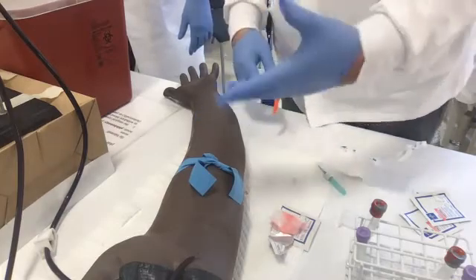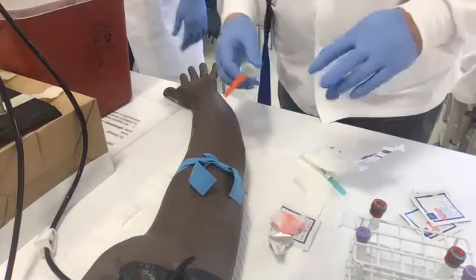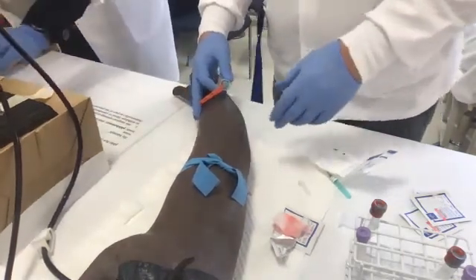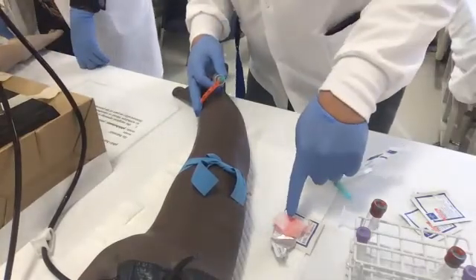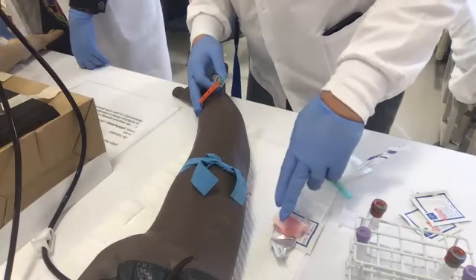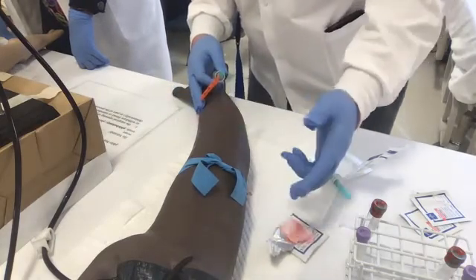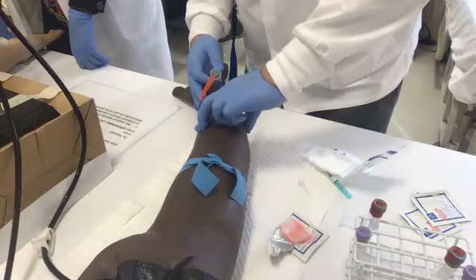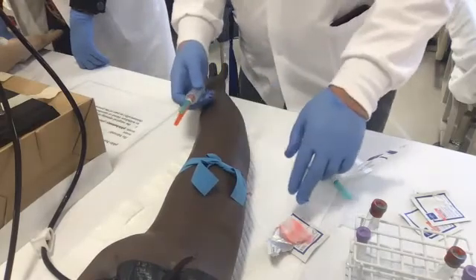This is already dry. I already did my small talk. You can put that on the side. So I'm like this, right? Remember that little gauze thing that I had extra? These aren't sterile, but if I go like this, it makes it a little cleaner. Then I can palpate to make sure I know where I am. Oh, here it is. Ooh, juicy. This guy works out. So now I know it's there.